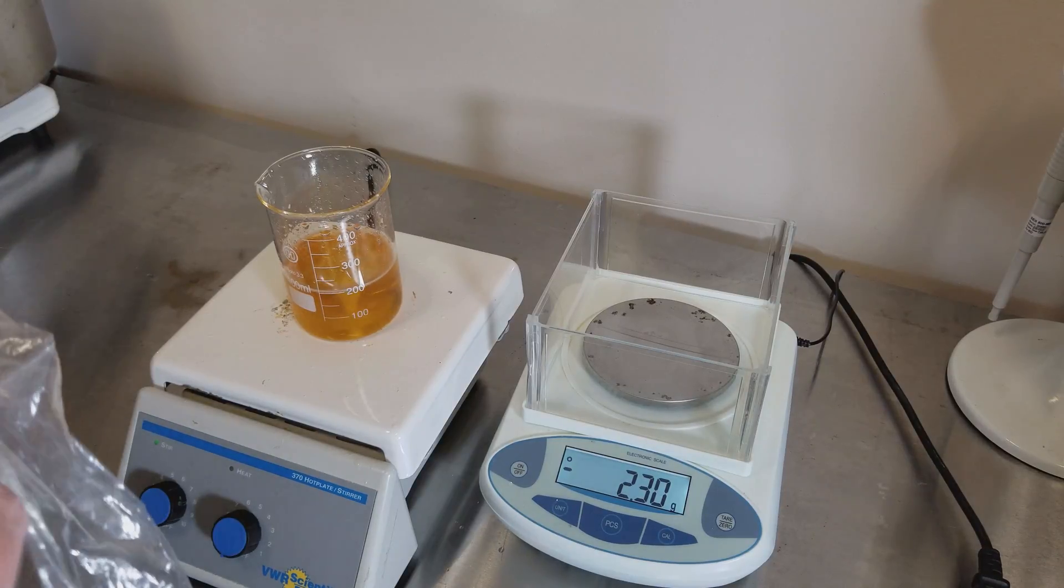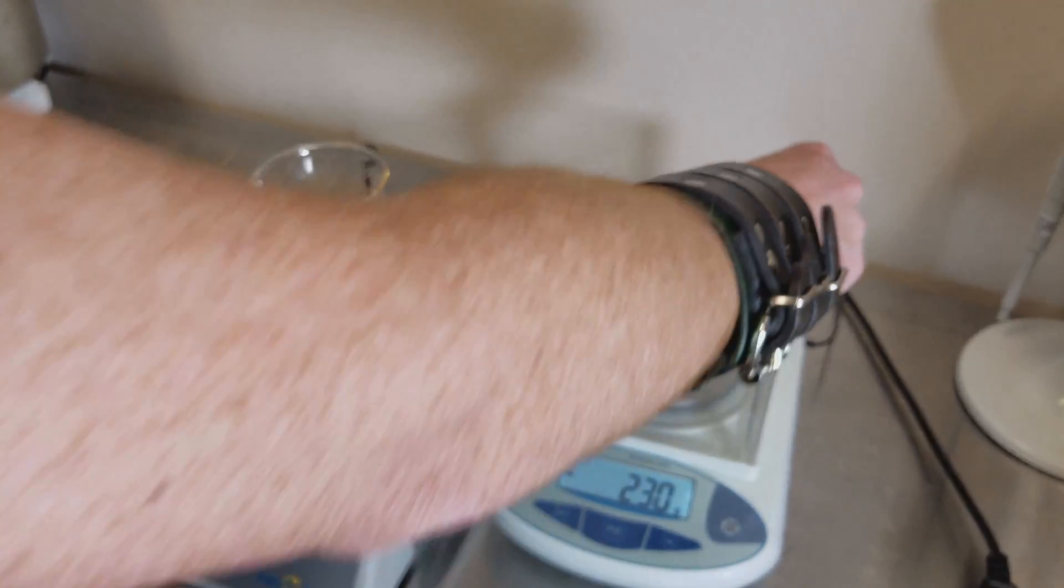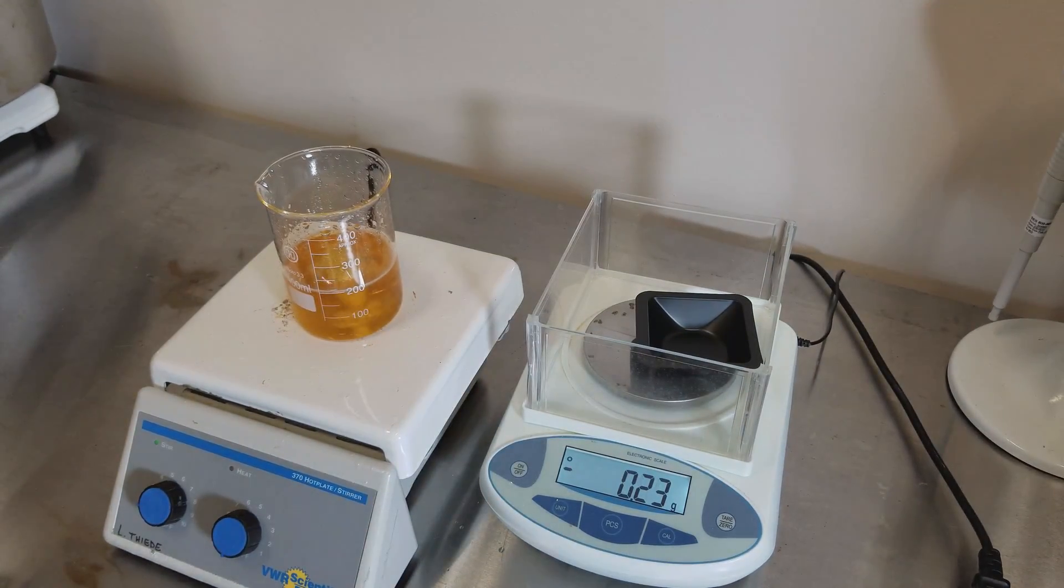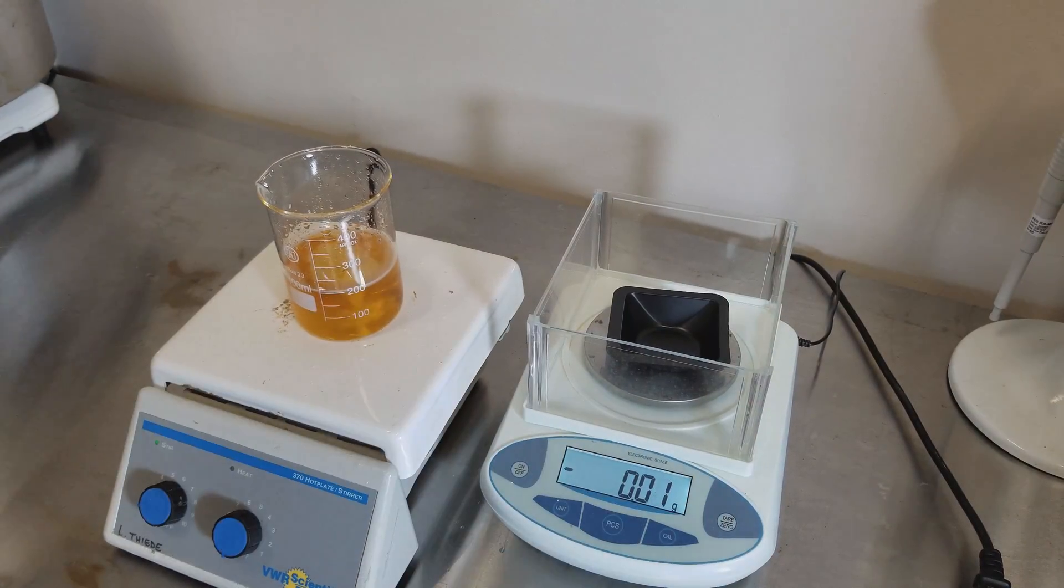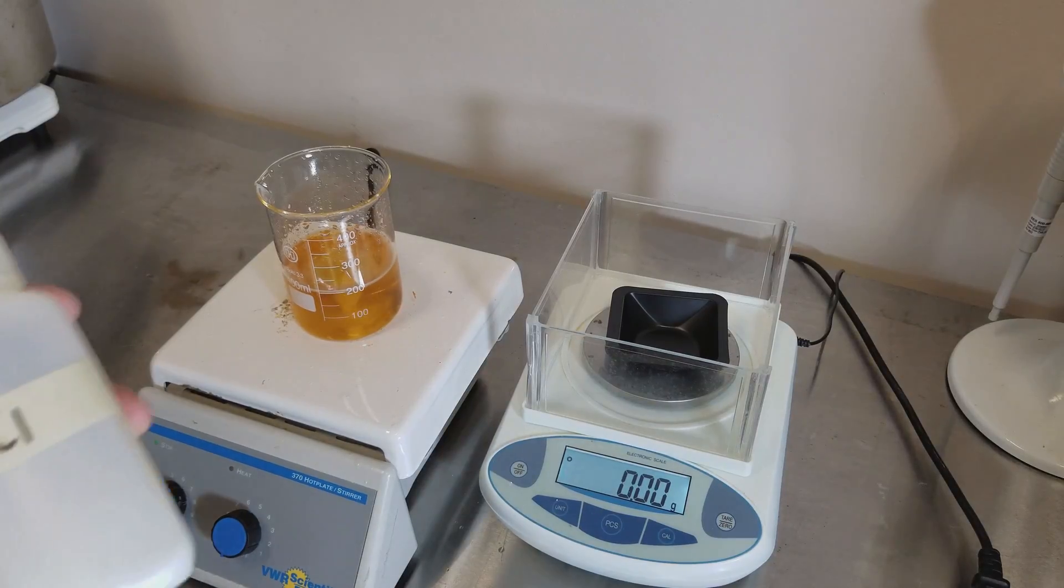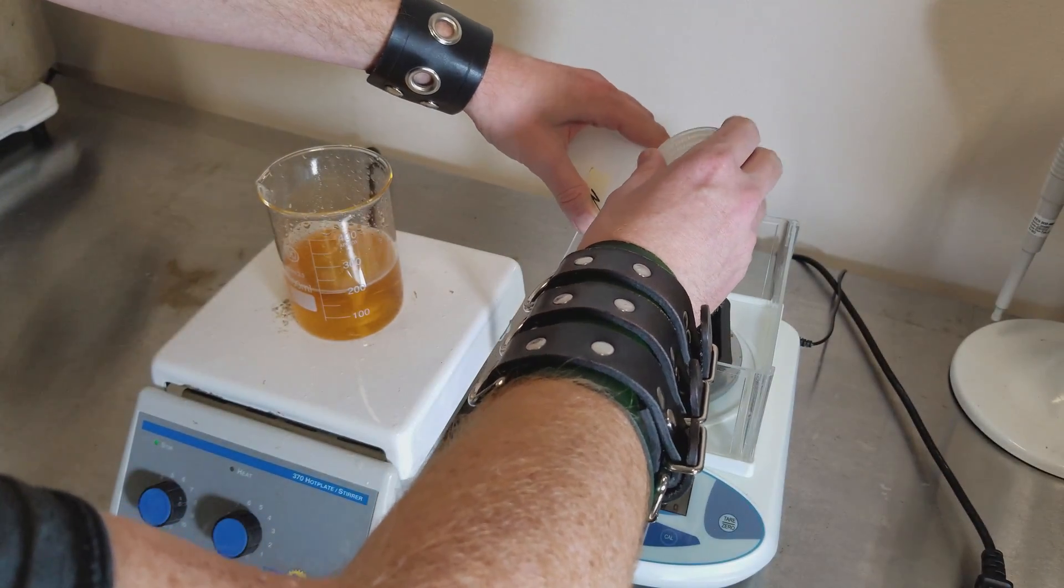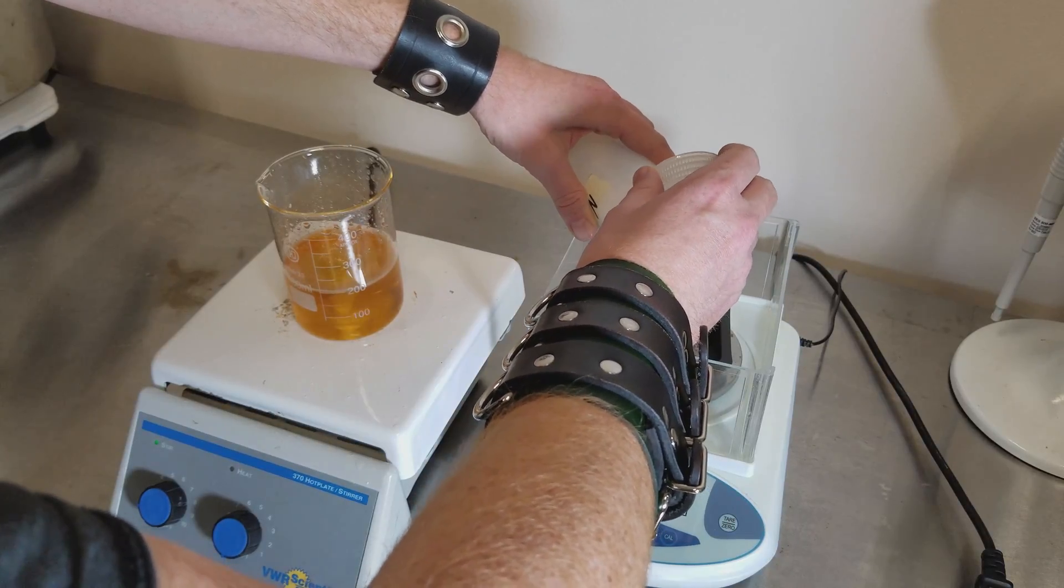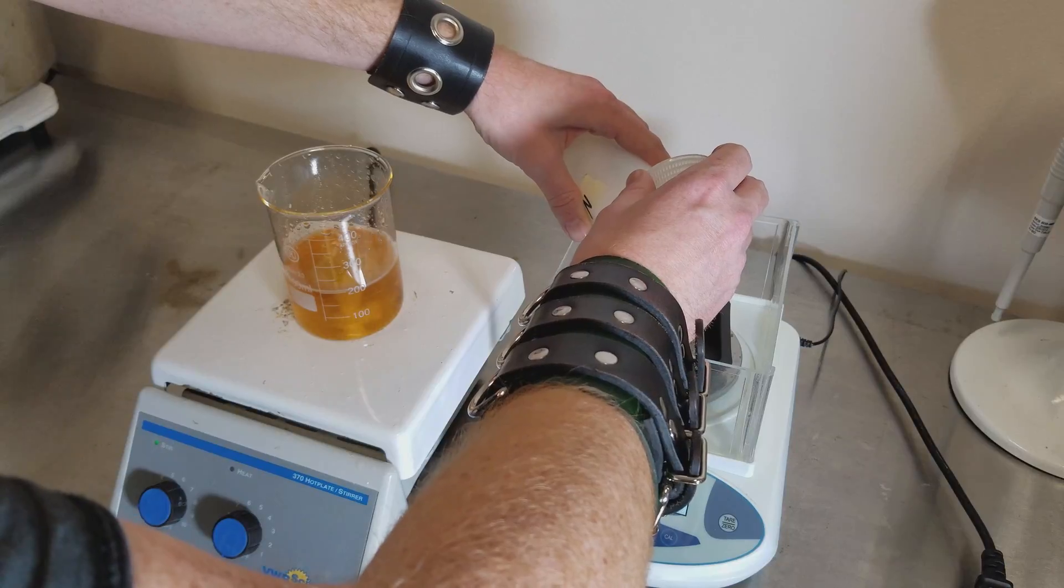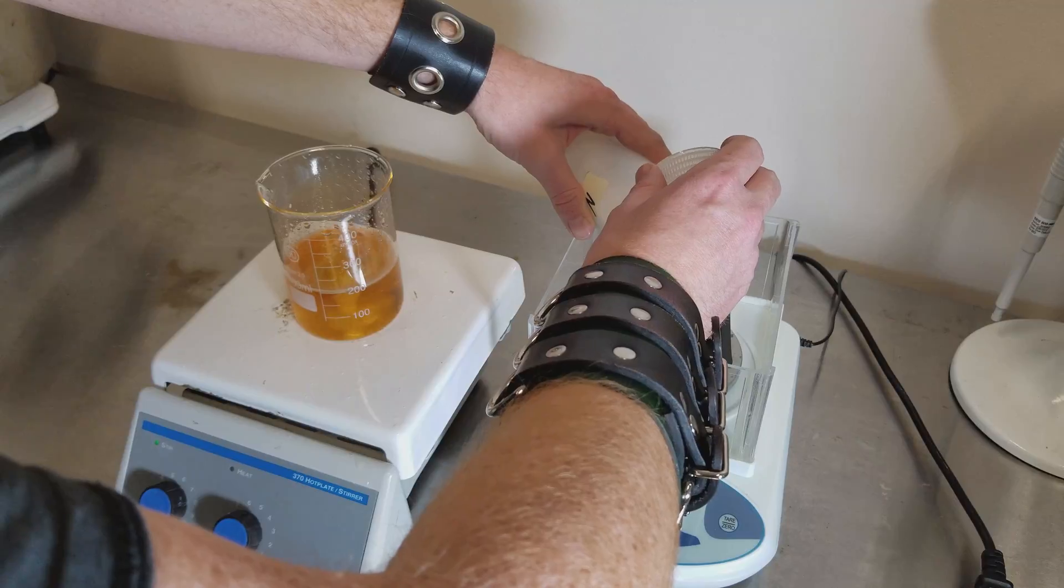Lastly, one more weigh boat. We need the sodium chloride. If we check our chart, it's another two and a half grams. So we'll take the salt and weigh out two and a half grams. Salt is pretty dense, so you can quickly approach your weight.